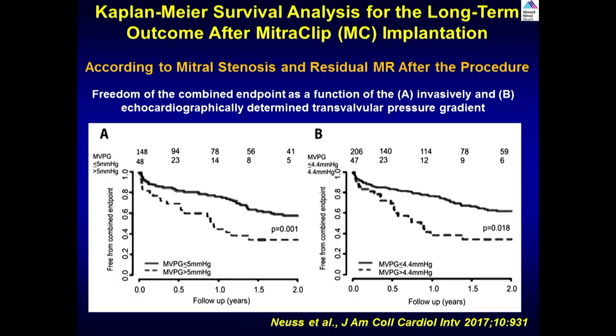But I think LA is very easy. We are not doing any extra LA catheter, which in the beginning was a teaching, that you put an extra pigtail in the LA and then you keep doing your clip with the second transseptal. No, actually, these guys from Germany, they did. They're from the same sheath.